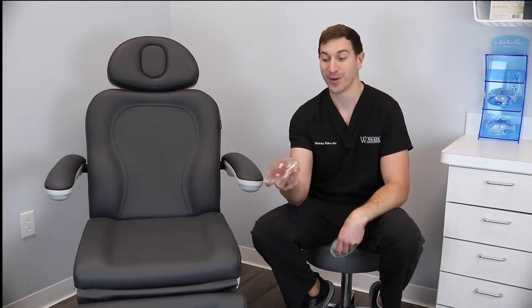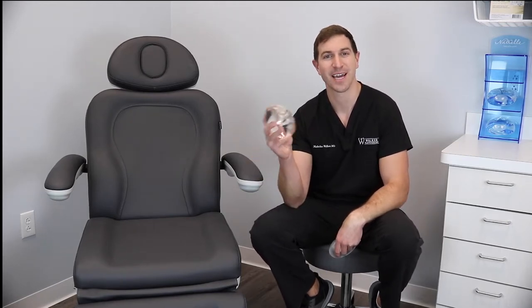Hey guys, Dr. Walker here. Ever wonder what's inside of a breast implant? Let's cut them open and find out.